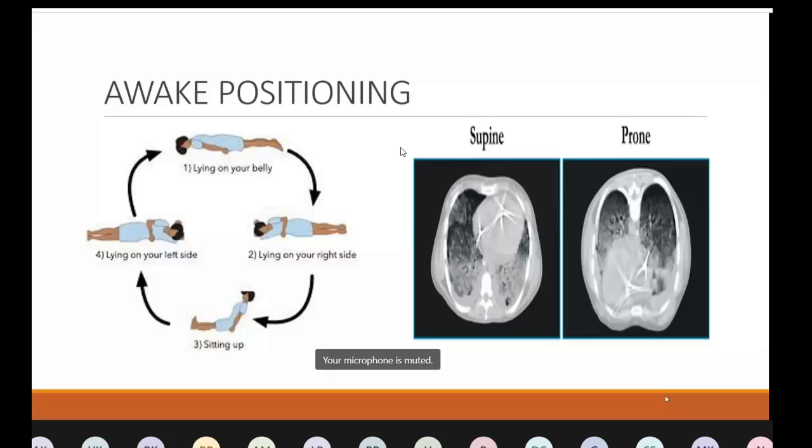So look over the nasal bridge. If your headgears are very tight, patients get pressure sores. We currently have a patient who has a pressure sore on the nasal bridge. Look into that. If there are pressure sores, keep at least a gauze or something like that there. We are giving high flows to these patients, and normally our sinuses and mucosa will humidify and heat the air.